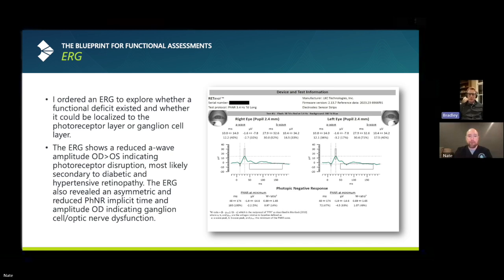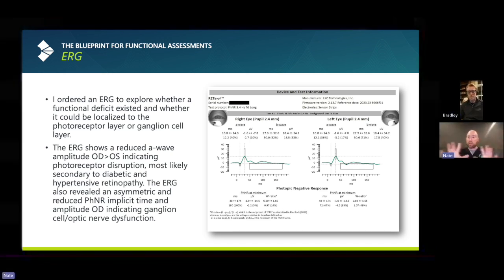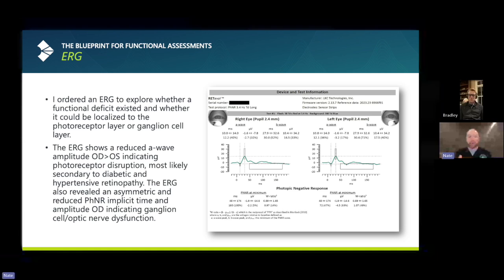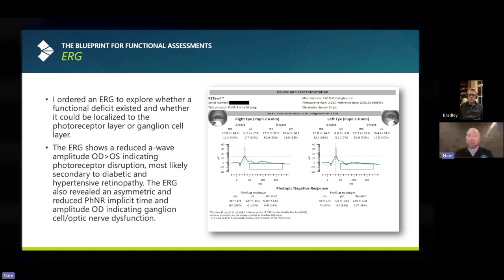Dr. Lighthizer, I think you might be able to answer this a little bit better, but isn't the DR score formulated from an A wave of one eye, a B wave of the other, and so it's a combination? The score itself is a combination of both eyes. Correct? That is correct. It's a combination of exactly what you just said. So it's looking at measurements from both eyes. So the number, the DR score, is a compilation of both eyes put together. You are absolutely correct that it is often asymmetric, and that's why I look at that.